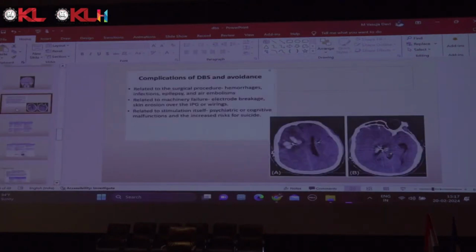Sometimes, rarely, you will have complications like this. There is usually less than a 1% chance, about one case out of 100 cases. But even so, with advanced MRI and contrast MRI, the risk of a bleed is very, very low now.